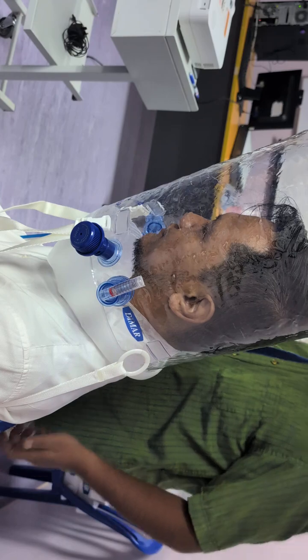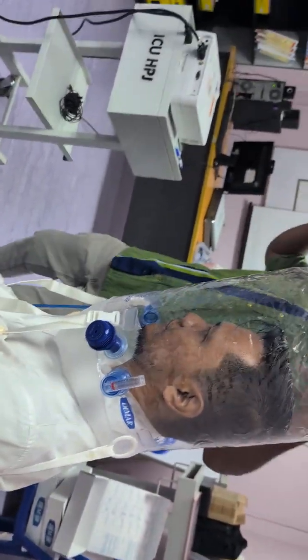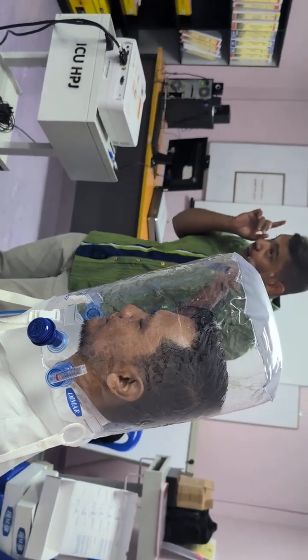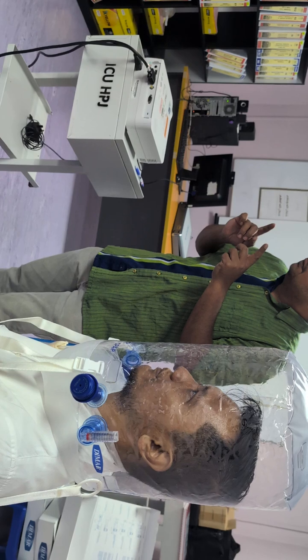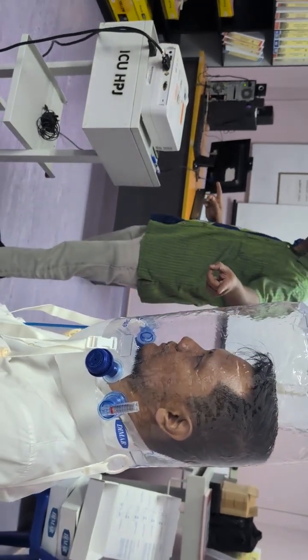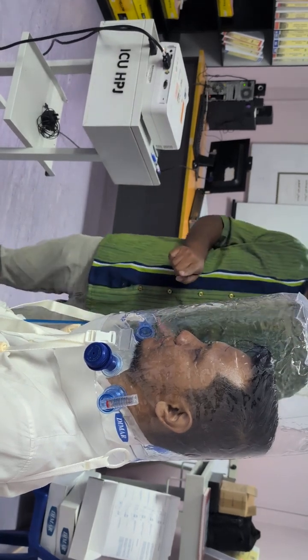All right. Patient will be more compliant because the patient can talk, the patient can read, the patient can do anything. But you have to remember this. In our normal venti mask, there is no this sound.